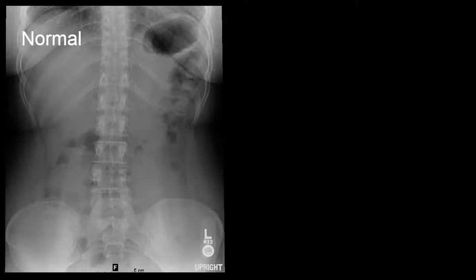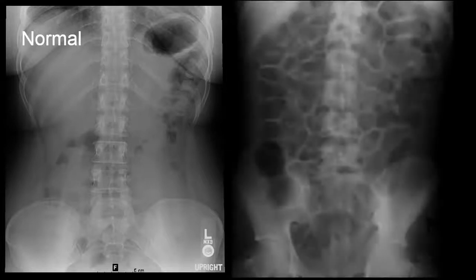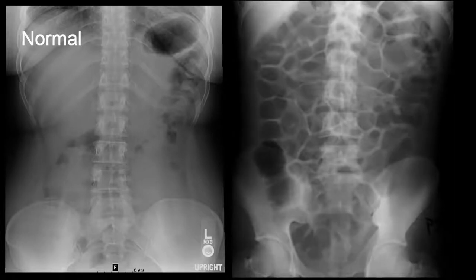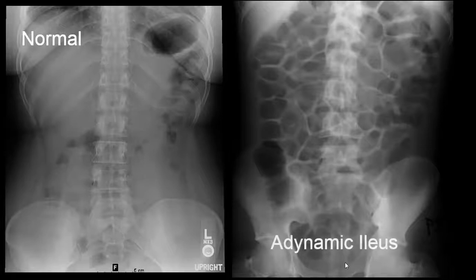Here we have another example of a normal radiograph, and in contrast, this patient has diffuse, balanced dilatation of the small bowel. This is an example of ileus, which can be seen after surgery or in patients who are on opioids.